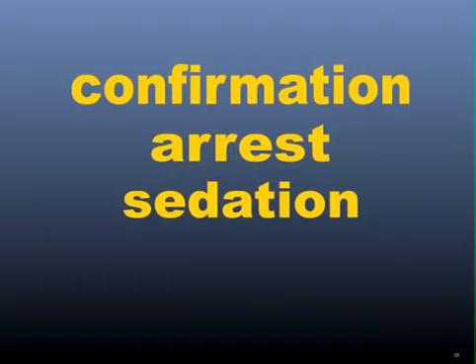So that's it. That's all you really need to know about capnography in the ED. It's the best way to determine if your tube's in the trachea. It's great to monitor CPR, and it's the best way to make sure your sedated patient is still breathing.